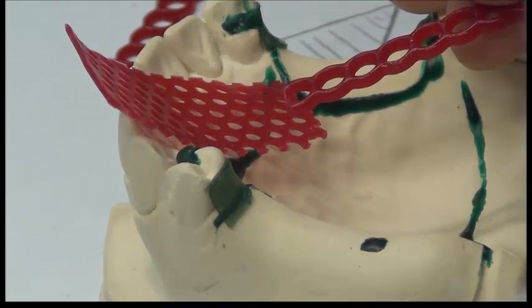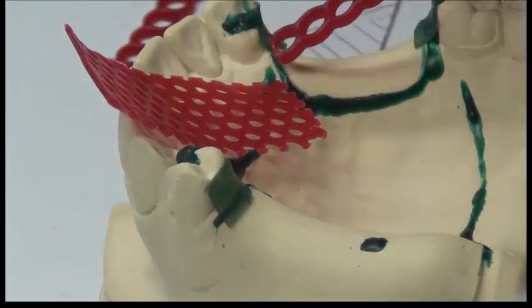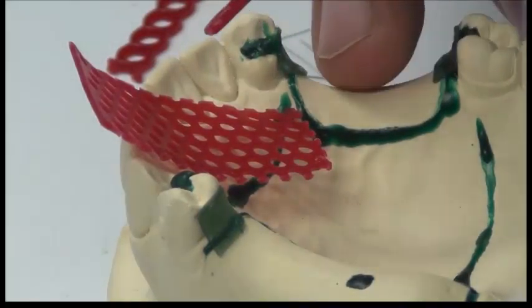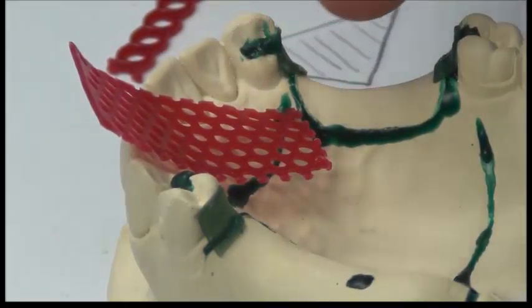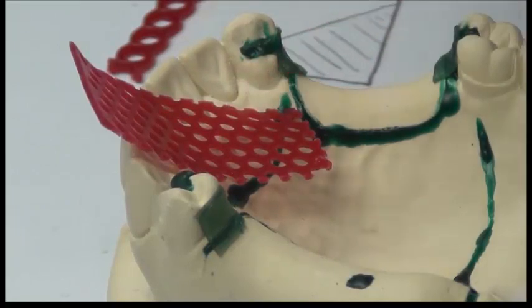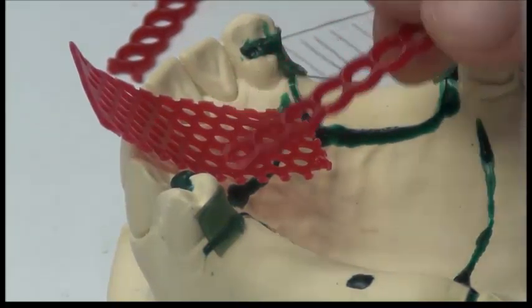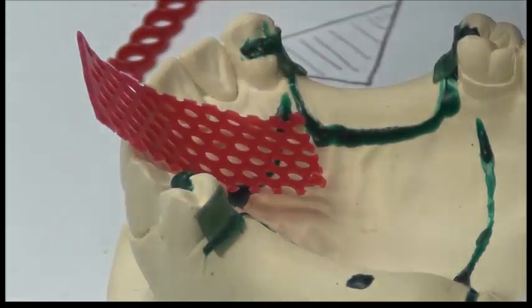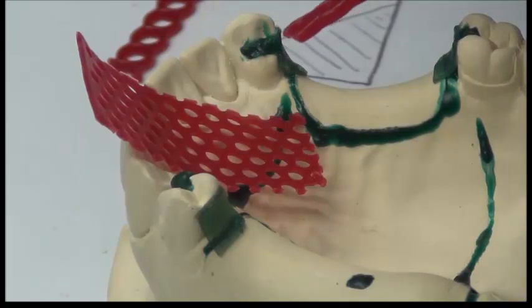But sometimes if I add it, I might not have enough bulk, enough interocclusal space with the upper teeth, and I could not set teeth if it was thick, okay? So the only thing that makes me shift from the open lattice to the mesh area is where we don't have sufficient interocclusal space, okay? And this usually happens in the upper.